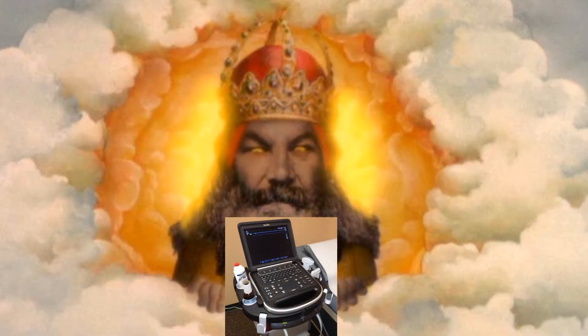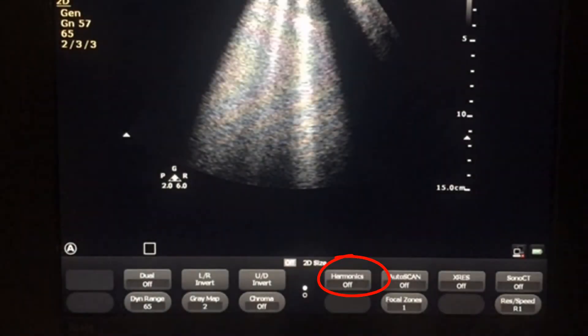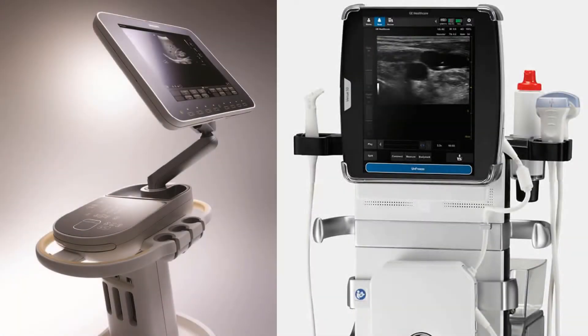Step three: remember these B lines are artifacts. Any ultrasound machine tries to decrease artifacts, so you need to turn off these filters. Turn off tissue harmonics — known as THI or CHI — and also turn off spatial compounding — known as SONOCT or multi-beam. These names change a bit from machine to machine.